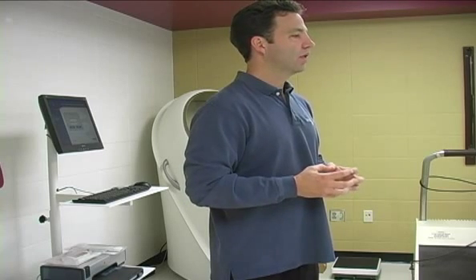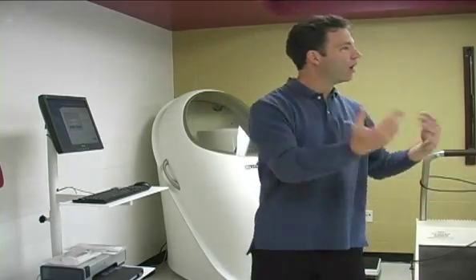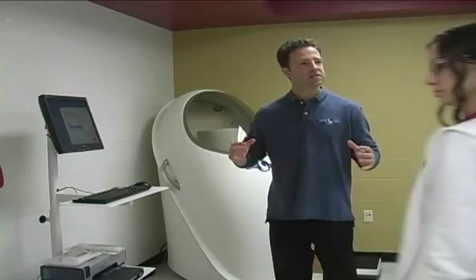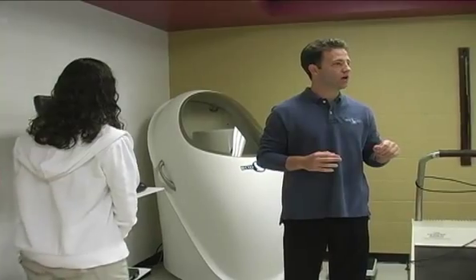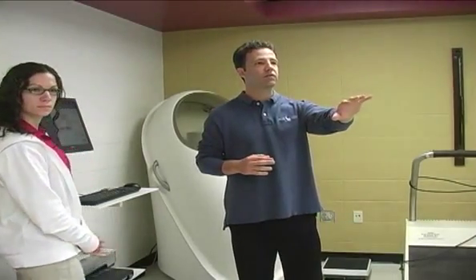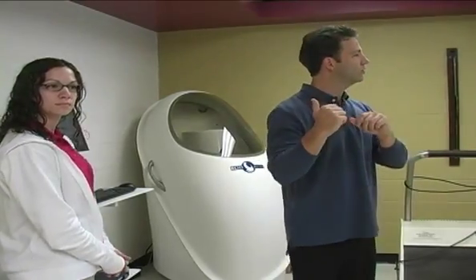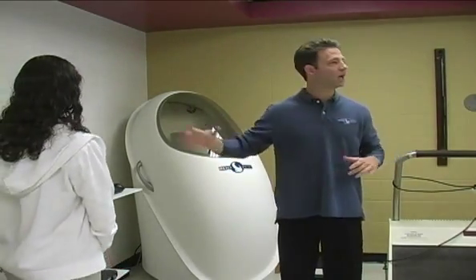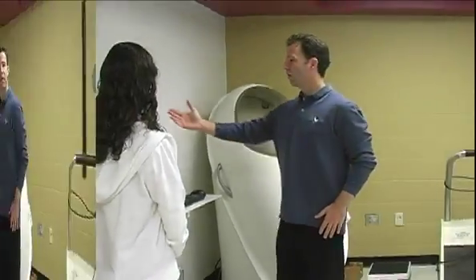So I am ready to do a test. I'm going to have Brittany do a test, and I'll walk you through it. The nice thing about the BOD POD test is subject involvement. The test is about 5 minutes long. But Brittany, thank you for volunteering, you'll only be involved for about 2 of those 5 minutes. So what we're going to do first is some calibration and enter your demographic information, so you won't have to get in quite yet. So we're going to begin a test, enter the demographic information, and do a body composition assessment.